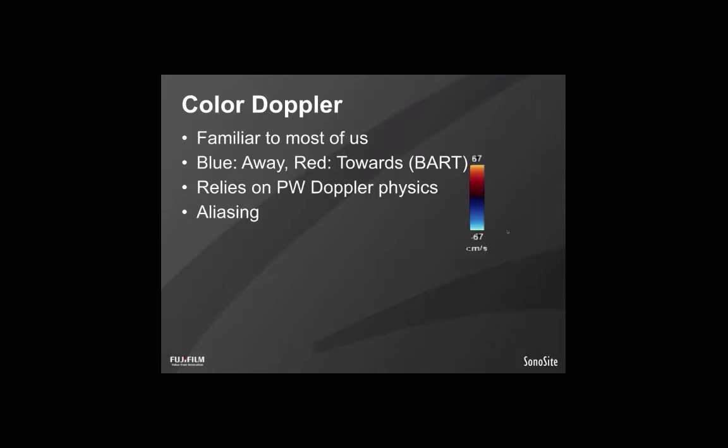And for those of us who struggle to remember this, we simply can look at the color map, which will always be on any ultrasound screen when you engage color Doppler, to tell you how it is choosing to code this direction of flow. And so you have the color information always that will show you the direction towards the transducer and away from the transducer. As well, these numbers, which we'll talk a little bit more about, represent the speed with which the ultrasound machine is sampling that blood flow, and we'll come back to that in a minute.